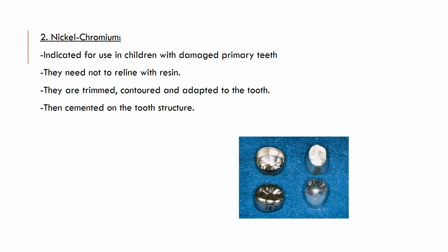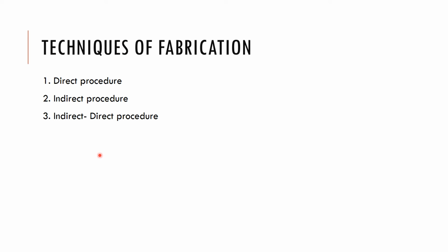Nickel chromium is indicated for use in children with damaged primary teeth. They need not be relined with resin. They are trimmed, contoured, adapted to the tooth, then cemented on the tooth surface.